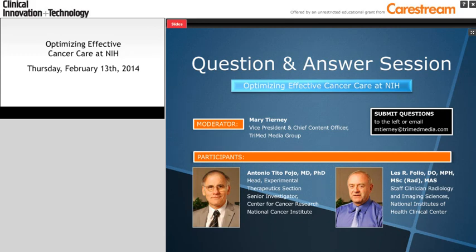In that situation, it's going to be really important to know what is happening to this rate as it goes along. And you can't get that by measuring a couple of lesions one time and a couple of different lesions the next time. And if physicians are going to do this properly and rationally and based on the data that is in the literature, they're going to need to have consistency. And something like this is going to provide that consistency for them. So I think that we don't have it now, but it's going to become essential. And I could see where it could even be a requirement.